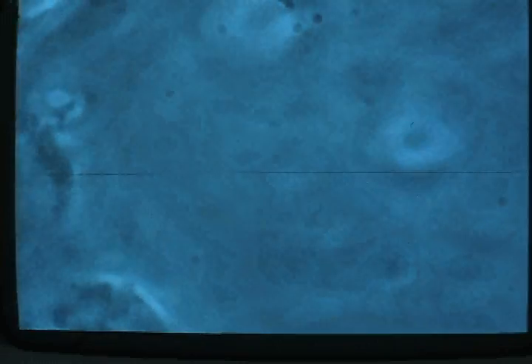This is a slide we just took of the tissue from the gingival curettage, and there is literally no evidence whatsoever of any viable bacteria in this sample. Just basically hardly anything recognizable — although there's a little bit of blood, that came out after the surgery. They're just nondescript tissue with a few red blood cells here and there. It looks like the CO2 laser literally goes in and vaporizes most of the sulcus, and what we're looking at is what's remaining.